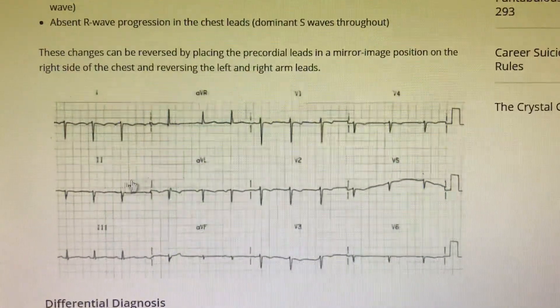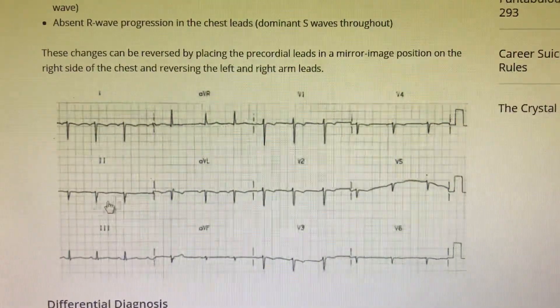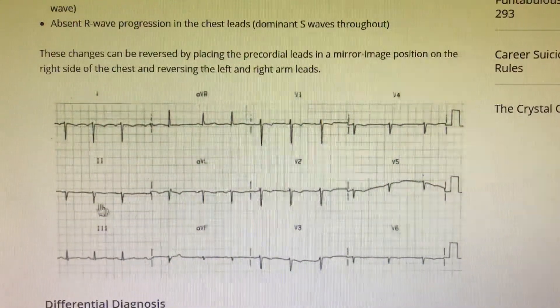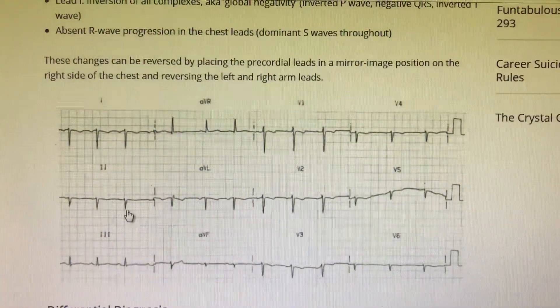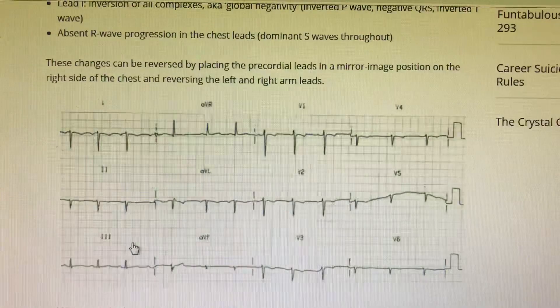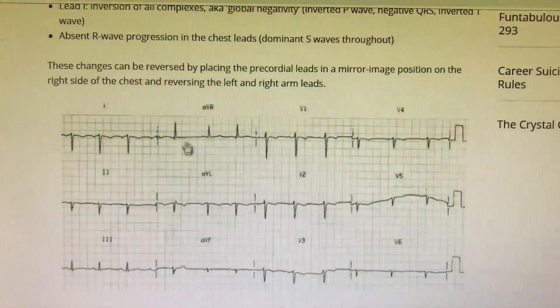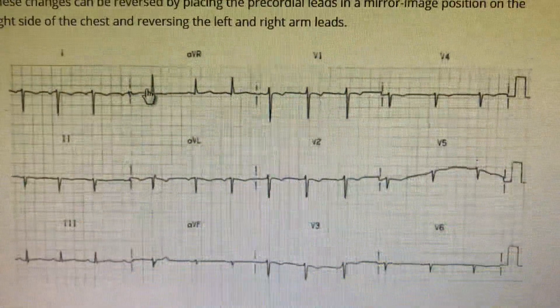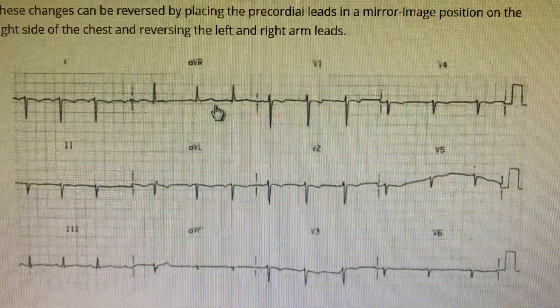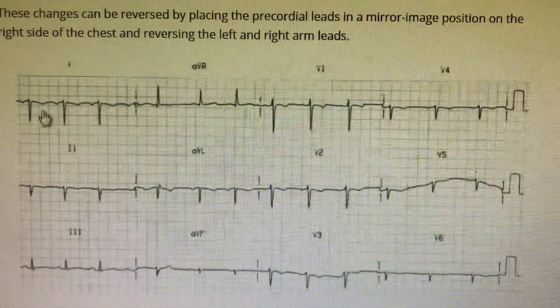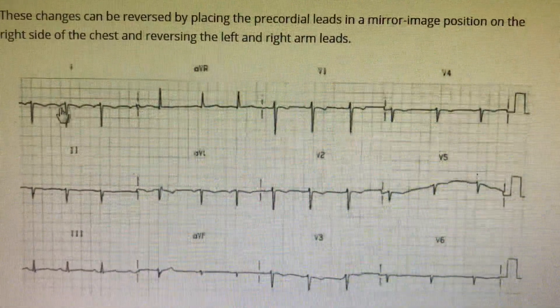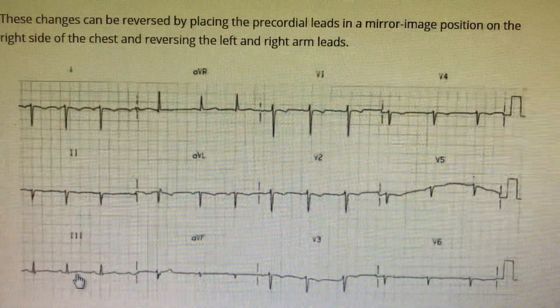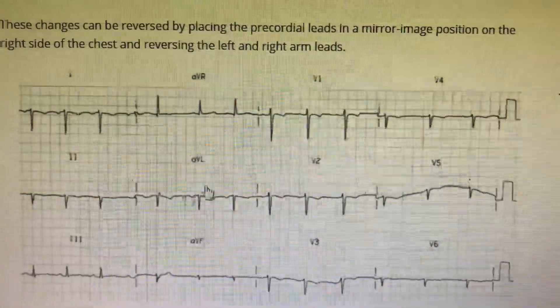Now looking at another similar ECG: immediately looking at lead II, there is a deep negative deflection, so you suspect the axis is not right. Then going to AVR, everything is positive — P is positive, QRS is positive, T is positive. Then you go to lead I and AVL — everything is inverted.